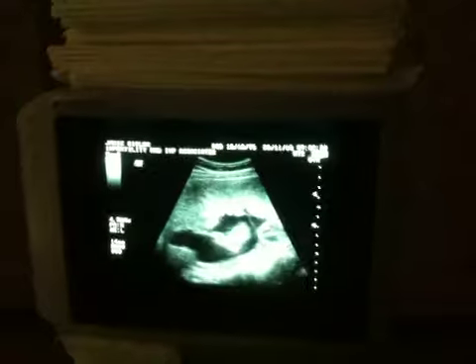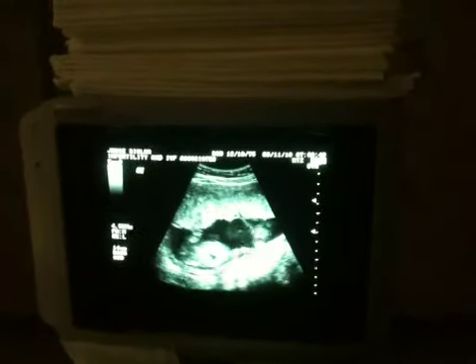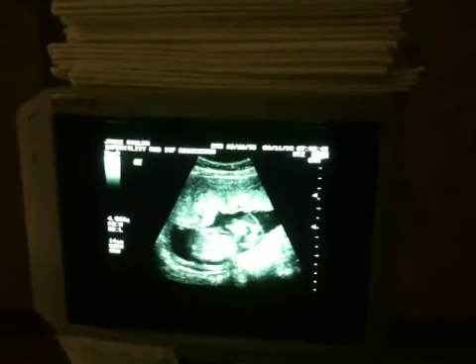Are you filming or just taking a little? Yeah, just taking a little midi clip. Okay, then let's get this little person here that way so you can see the length of the body.